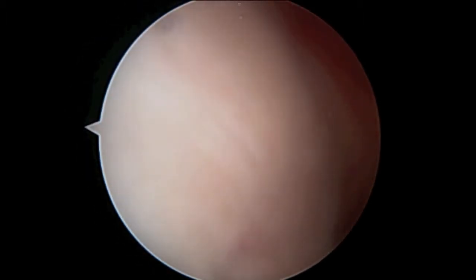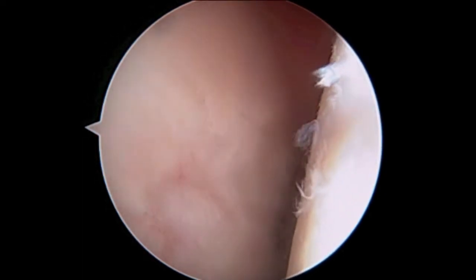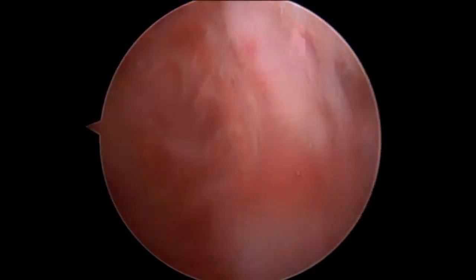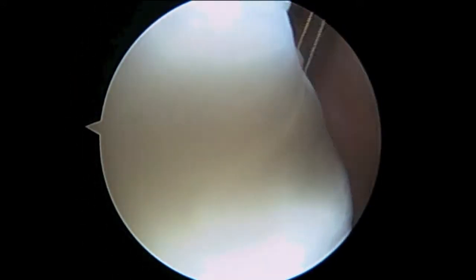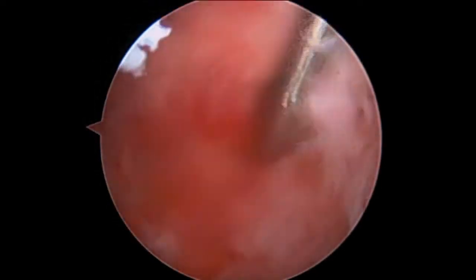Upon inspection, it is clear that the front of the socket has been damaged and that the normal convex contour has been crunched into a concave or indented contour. With this metal instrument, I'm exploring the quality of the labrum and ligament tissues in the front of the shoulder to see how stout they are, and whether a repair of these tissues would suffice to provide this football player sufficient shoulder stability.